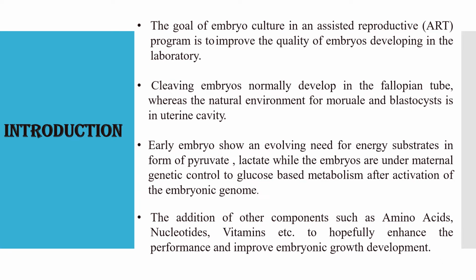Optimization of the culture media is essential, along with optimizing all the other components of the culture system, including the environment and equipment used.